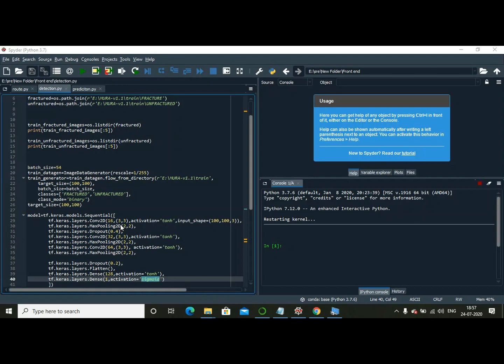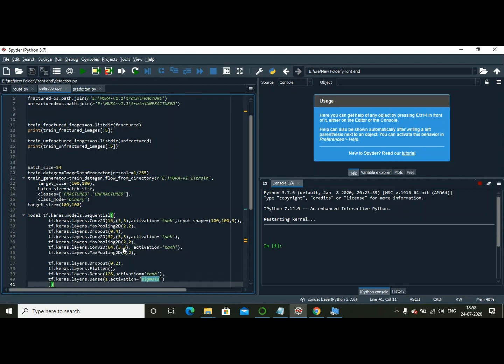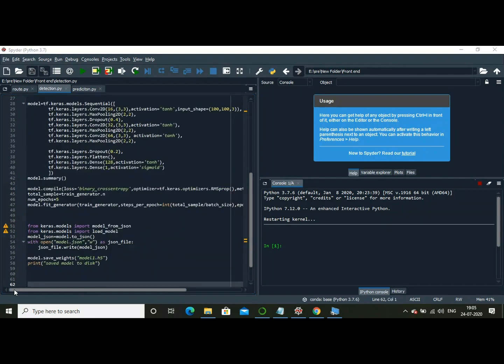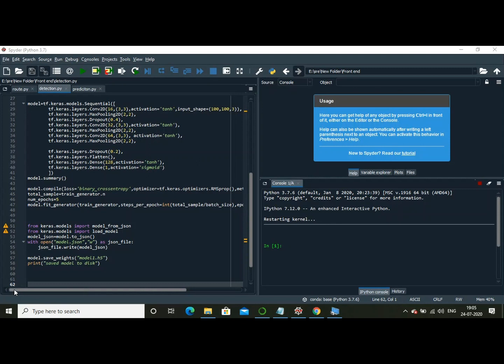Similarly, I have done it for four other layers. When it comes to the last layer, I have preferred sigmoid over tanh. It is because the sigmoid activation function ranges from 0 to 1 and hence is used for binary classification. We can simply say that the sigmoid activation function depicts the probability of a data item to belong to a particular class.